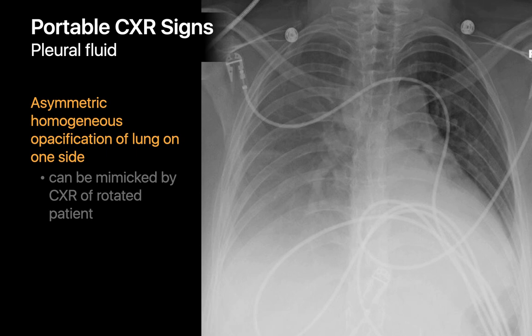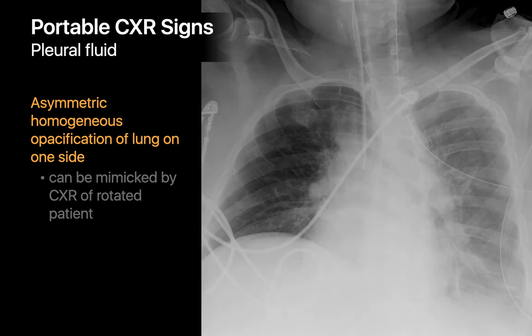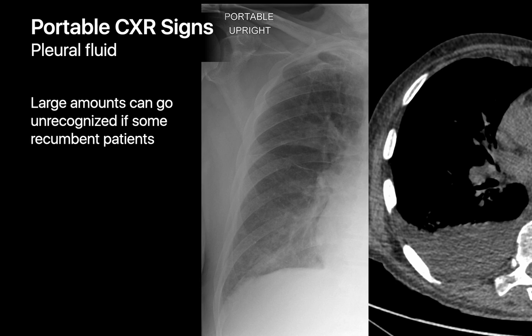When calling a large unilateral layering pleural fluid accumulation, ensure the patient isn't positioned obliquely, since oblique positioning can mimic a unilateral layering pleural effusion — recognizable by asymmetric appearance of both clavicles and the rib cage. Also be aware that sensitivity for pleural effusions can be limited: over a liter of pleural fluid may be present in a patient's chest while the lateral costophrenic angle appears sharp, with no lateral pleural band and no apical pleural cap.